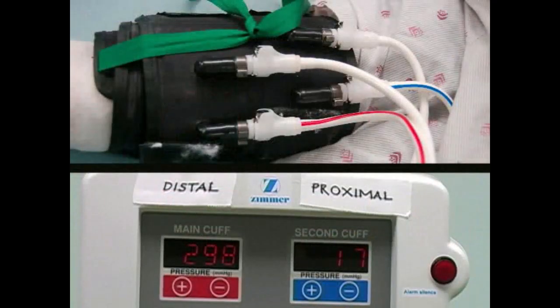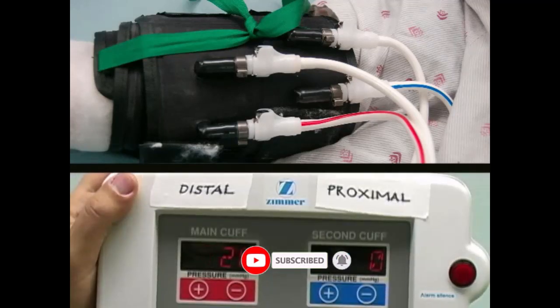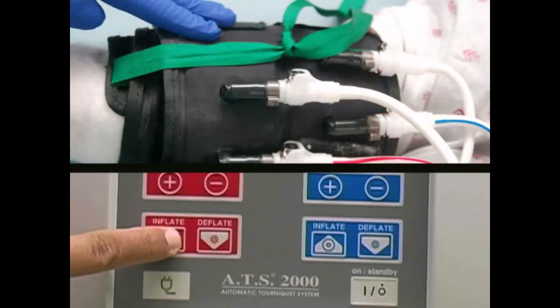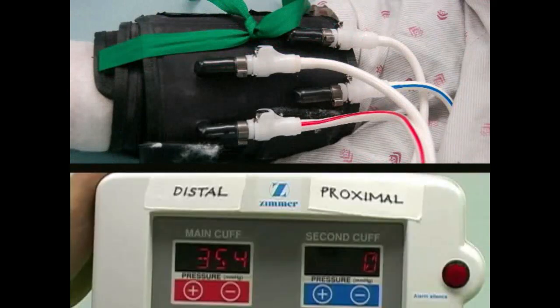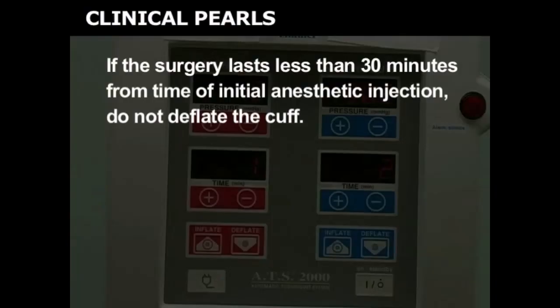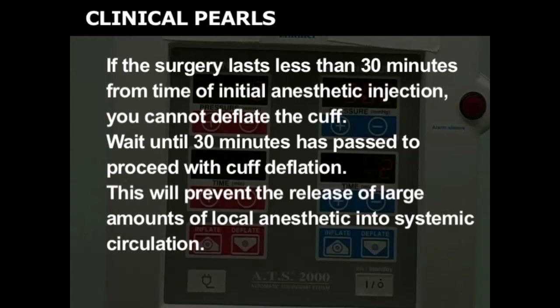At the conclusion of the surgery, deflate the cuff methodically and carefully through repeated cycles of cuff inflation and deflation to minimize the amount of anesthetic released at any given time. Deflate the distal cuff for approximately 30 seconds, then re-inflate the cuff. After re-inflation, wait 30 seconds before releasing the pressure again. This process needs to be repeated at least once, but an additional cycle can be performed if needed. If the surgery lasts less than 30 minutes from the time of initial anesthetic injection, do not deflate the cuff — wait until 30 minutes has passed. This will prevent the release of large amounts of local anesthetic into systemic circulation.